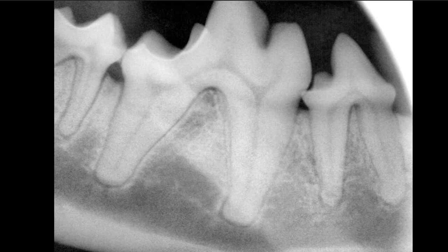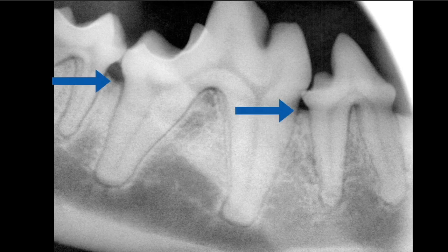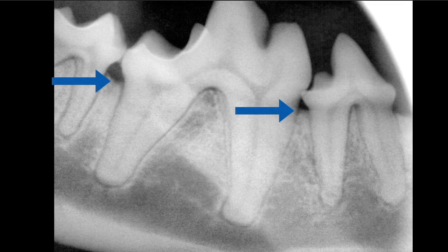Looking at a pretty normal radiograph of those three teeth and the bones surrounding them, the number one thing we're looking for is a change in where those arrows are pointing. That level of bone is called the marginal bone height, and if we get any decrease in that height adjacent to the tooth, where that bone starts to move down toward the apex, that's significant — that is an indication of periodontal disease.